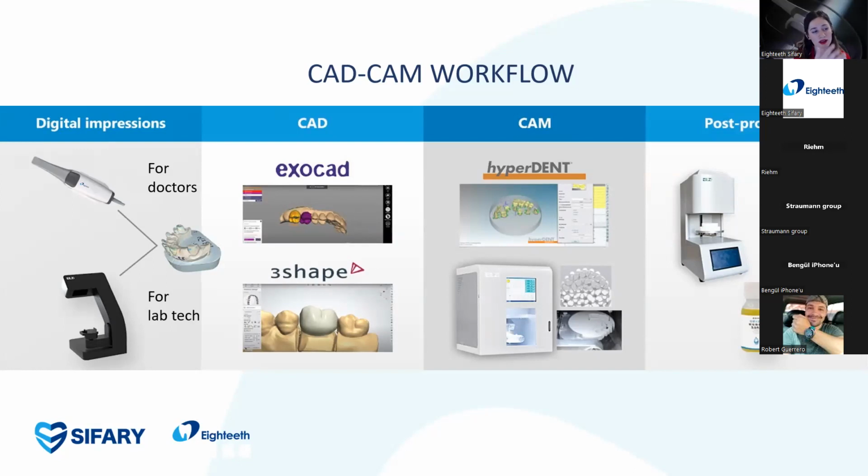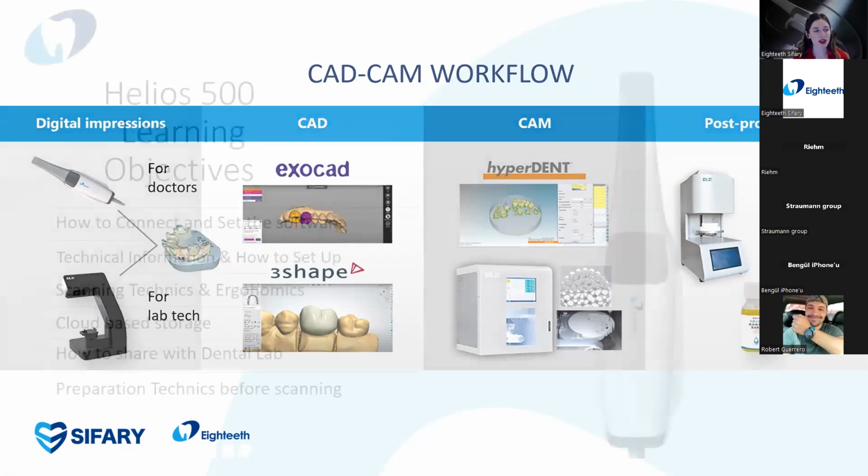Vice versa, the laboratory, after getting the model, needs to scan the model again and continue their process. So we are jumping ahead and saving a lot of time. Yeah. Okay.